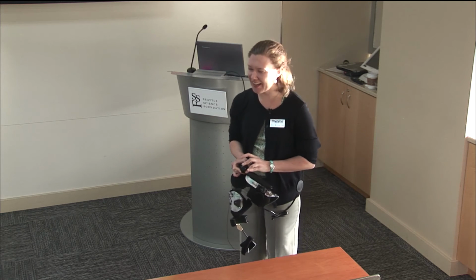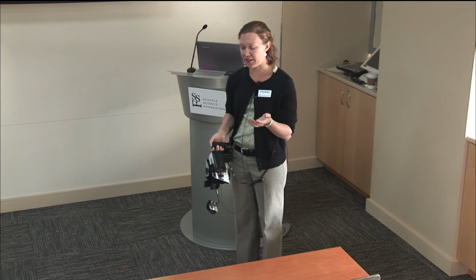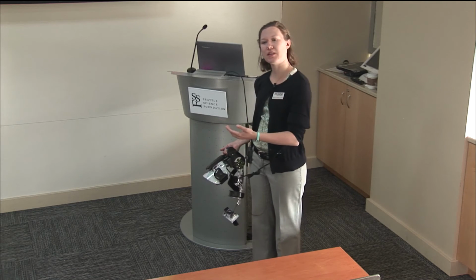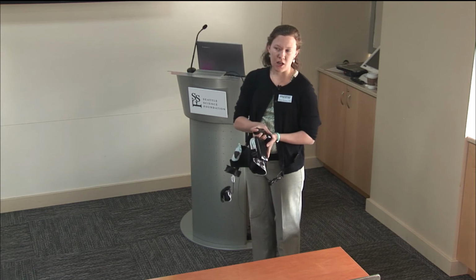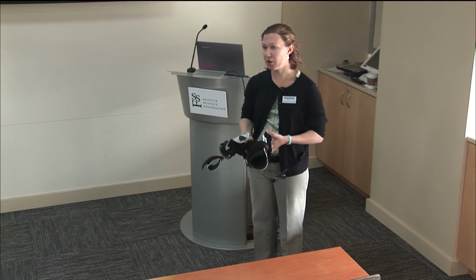ALS and MS, I'm sorry, those acronyms are wrong. And basically what we find is that the earlier those patients are fit, the better. Some patients will accept it. Some patients do not want to accept it. They just want to try and figure out their life as they continue through their disease process. But those patients are appropriate candidates provided that they do meet the other benchmarks.